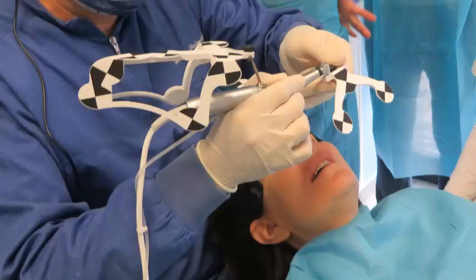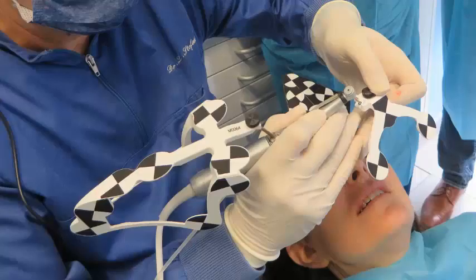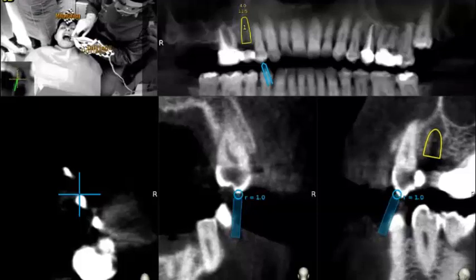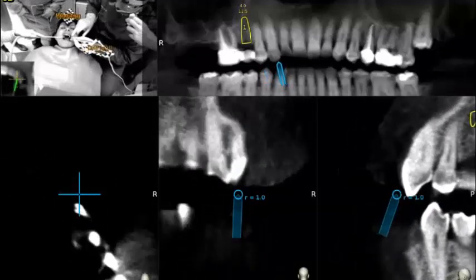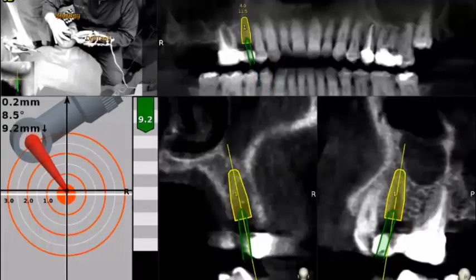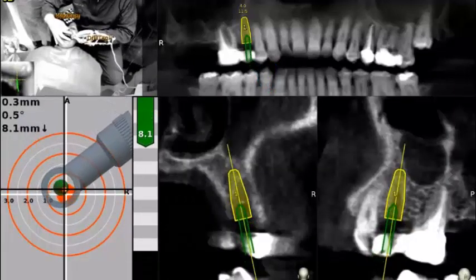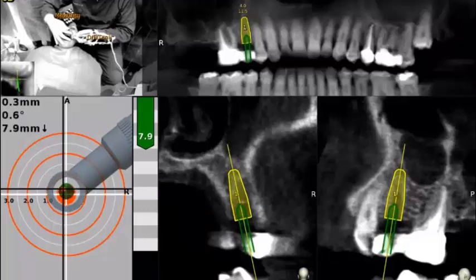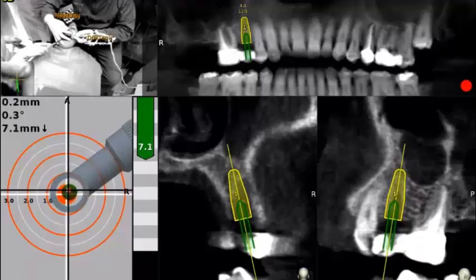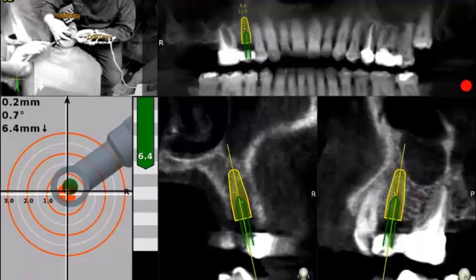Then we start our standard axis calibration, in this case using a jaw tag, which has been used outside the mouth and then shown to the cameras. Then we prove and check the accuracy of the drill by touching adjacent teeth and measuring the congruency between what we do and what we see. After that, the surgeon starts drilling, following the crosshair and pinpointing the center of the crosshair.